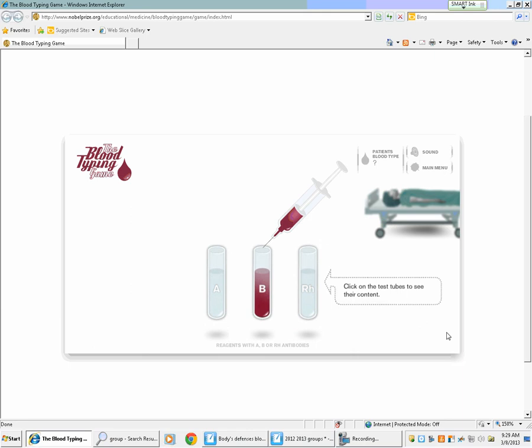What happened when we put the blood into test tube B, doctor? It mixed. So we're looking at patient's blood plus the contents in test tube B. We added the two together. What happened? It mixed. There's no separation. And this was the second. She didn't do test tube A. She did test tube B. So make sure you're putting it in the right spot.